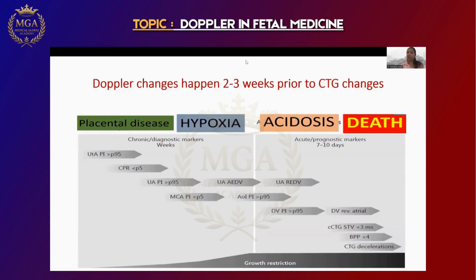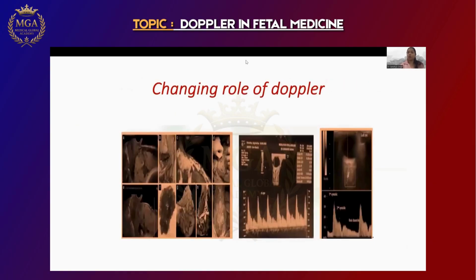Likewise, you will understand whether you could have picked up even earlier, then you can counsel the patient in that way. The patient also will understand that they will not undergo all these consequences which they are suffering now. Long ICU stay, baby having HIE, all those are very bad. So these are the normal things we do in Doppler.